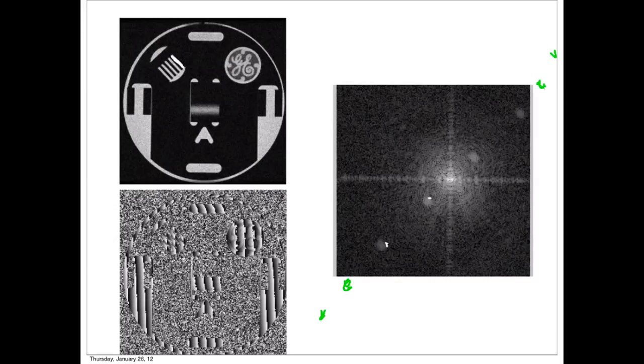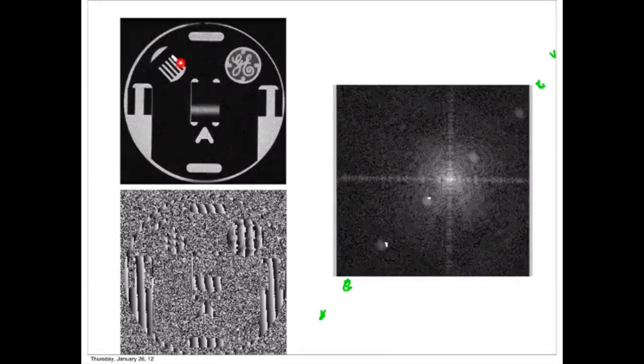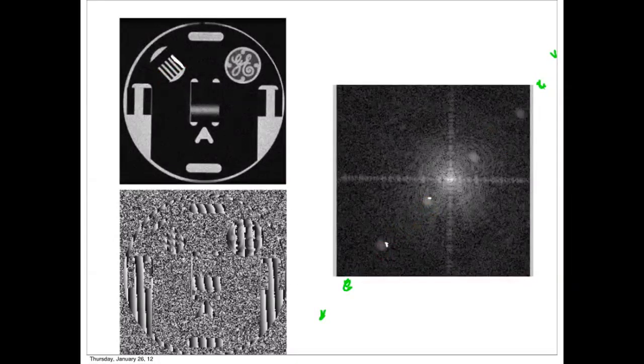Yeah. So this can all be derived by Fourier theory. You can figure out what is delta x, and what corresponds to what, and why this is so wide. That probably depends on the length of this and all sorts of things like that. It's atypical to see a very clear structure in the Fourier domain that you can match to a structure in the image domain. Because this is periodic, it's very easy to see. Otherwise, it's very hard.